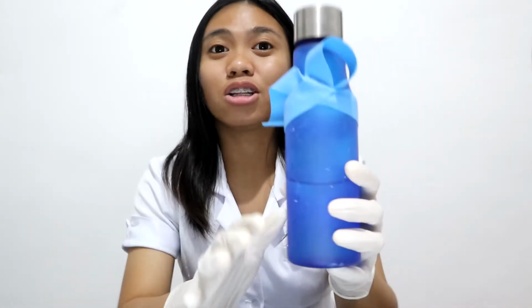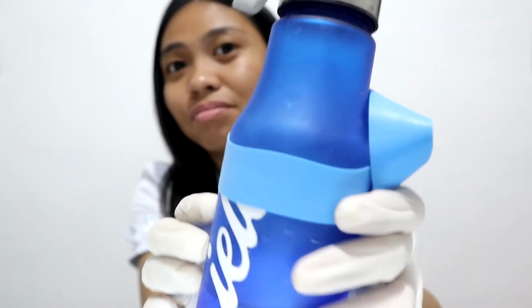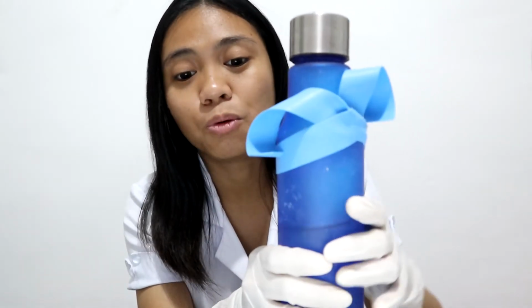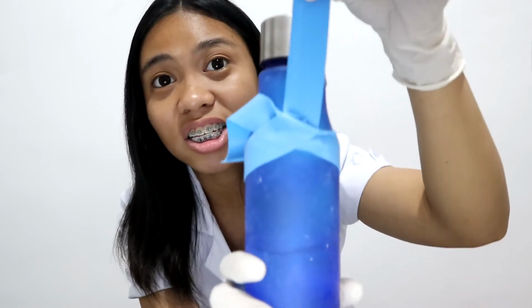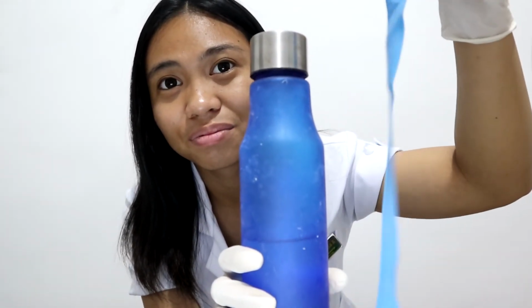Then, it should not be placed in a crumpled way. As you can see, it is placed cleanly. And most importantly, it is easy to pull once the venipuncture is done. Once the venipuncture is done, this is easy to pull out like this. That is how you apply the tourniquet.